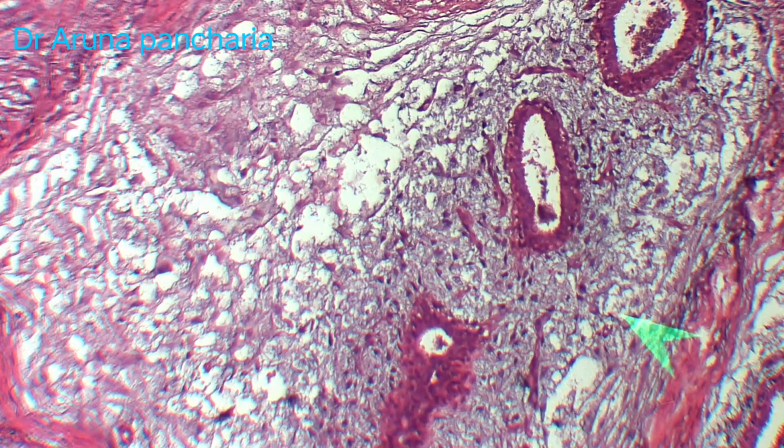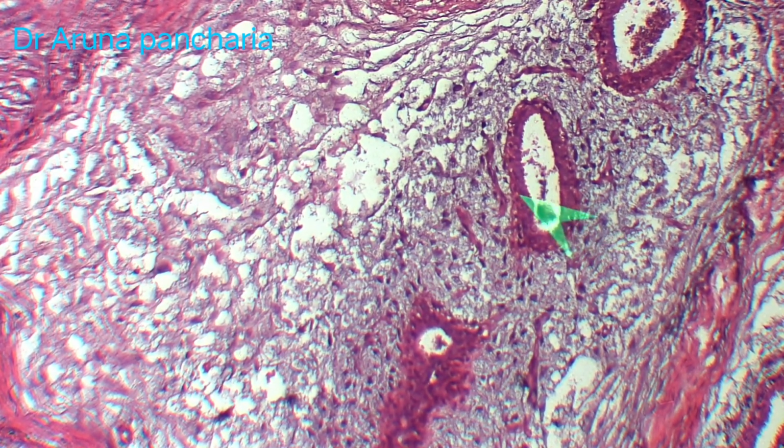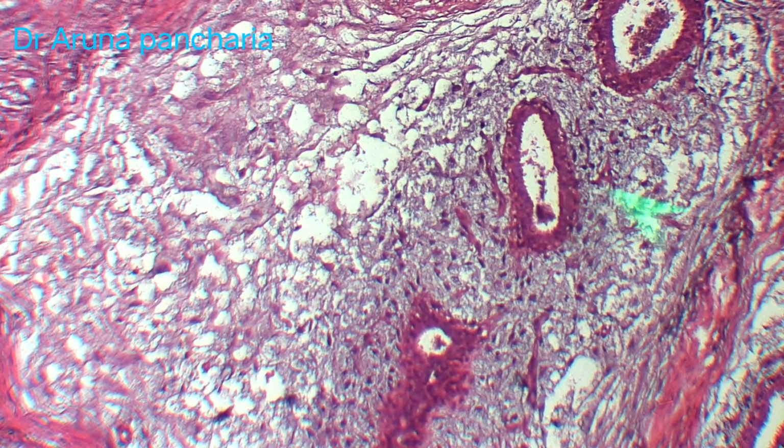There are two types of patterns. The other one is the pericanalicular pattern. When the glands become dilated, the glands are dilated and the stroma encircles these glands.